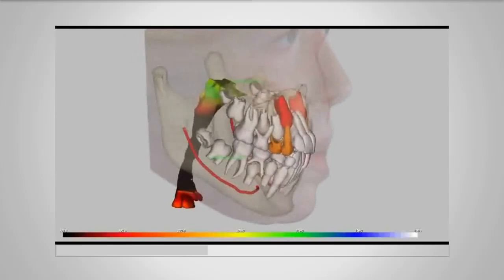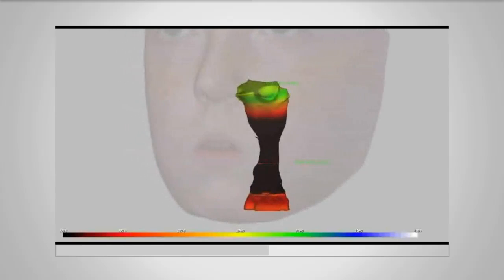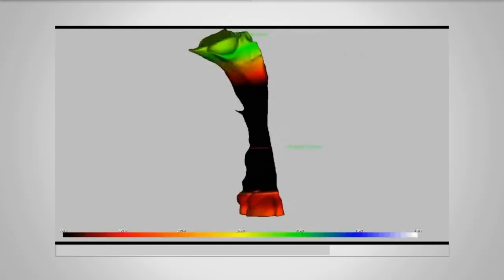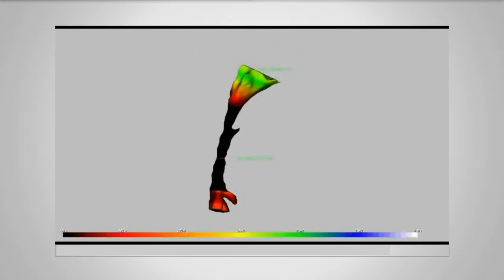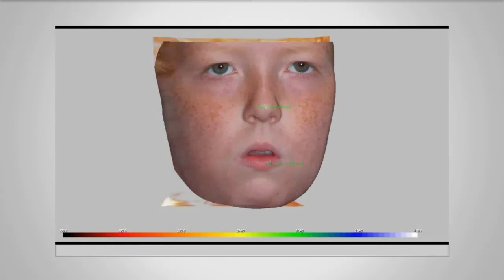But when you really look at this airway, this is quite frightening. This patient is basically suffocating. For sure, this patient has obstructive sleep apnea. And so it's easy to make the referral to a medical team to manage this patient, but also to consider the effect of facial orthopedics in trying to help promote facial growth.